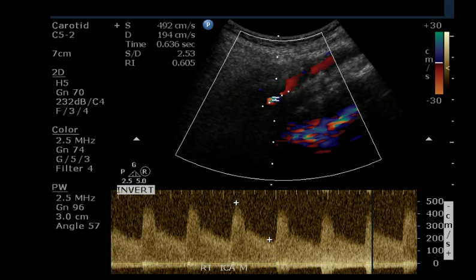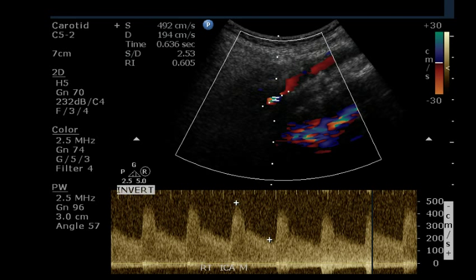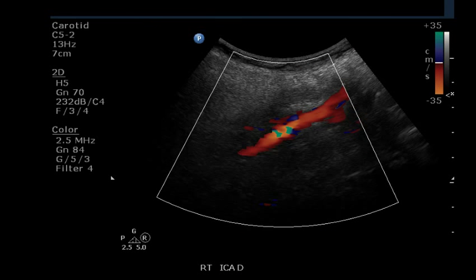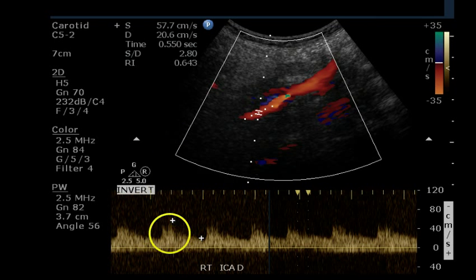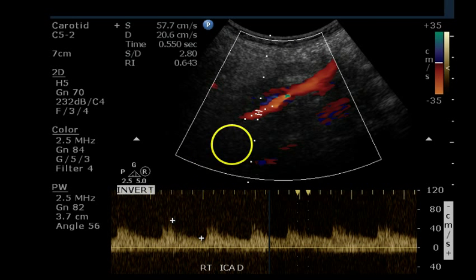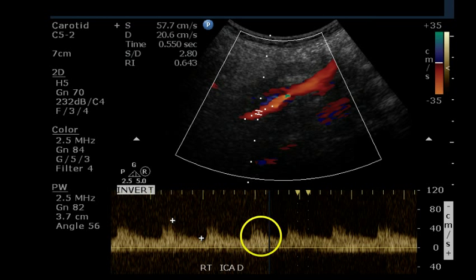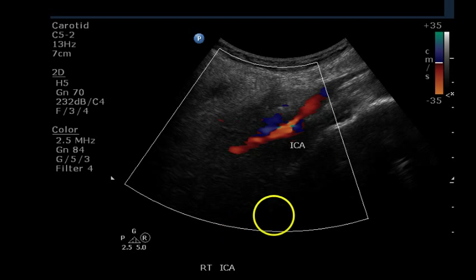We are looking at the highest velocity obtained — nearly 500 centimeters per second in systole and nearly 200 in diastole — clearly a very high-grade stenosis. In the distal portion of the artery the signal gives us much lower velocities, and we are now out of the area of stenosis looking at post-stenotic flow. We see a zigzag parvus tardus, sometimes called a sawtooth patterned waveform, with significant spectral broadening.